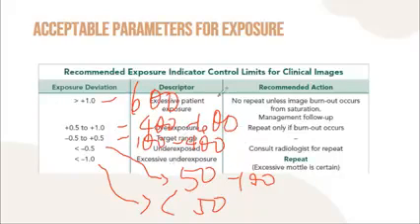It is not true for all, so you compute the values yourself. But yes, for Fuji, these are the ranges for exposure deviation. At 600, the patient exposure indicated is excessive. From 400 to 600, that's overexposure.